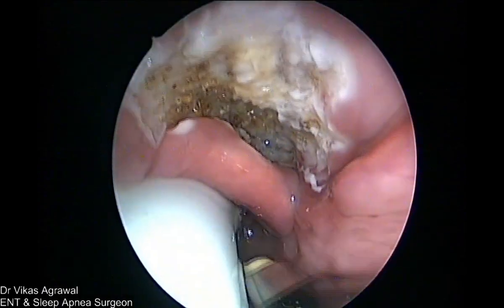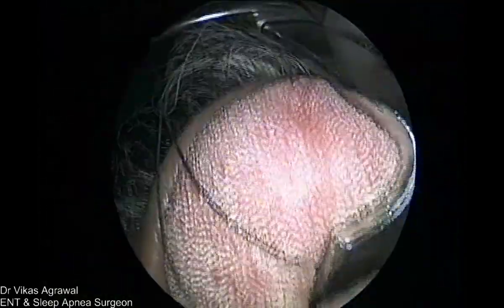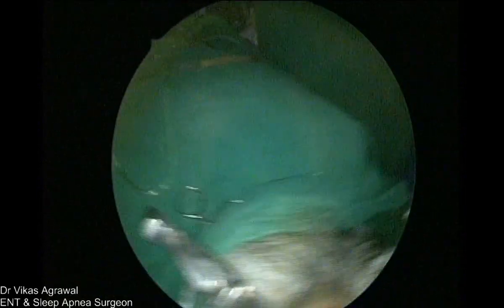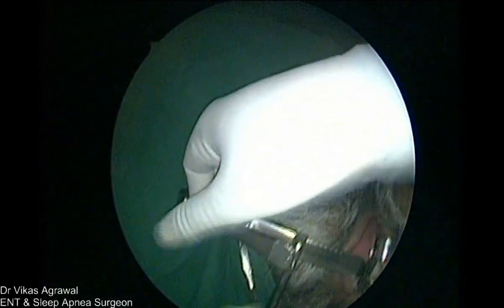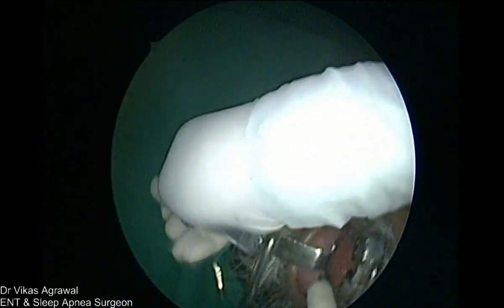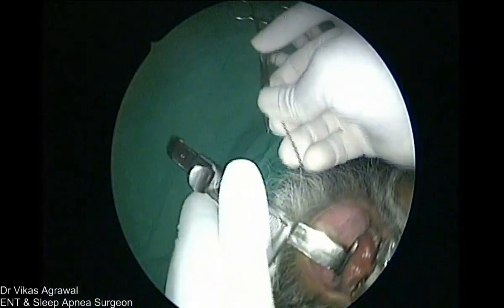Now we need to go on to the left side. It's already 10 minutes, so I'll say 12 minutes. Can you see the color of the tongue? It should not become dark. So I have released the tongue at 10 or 12 minutes. Now we'll let it vascularize once again. Change this to the left side a little bit. No, that's fine.